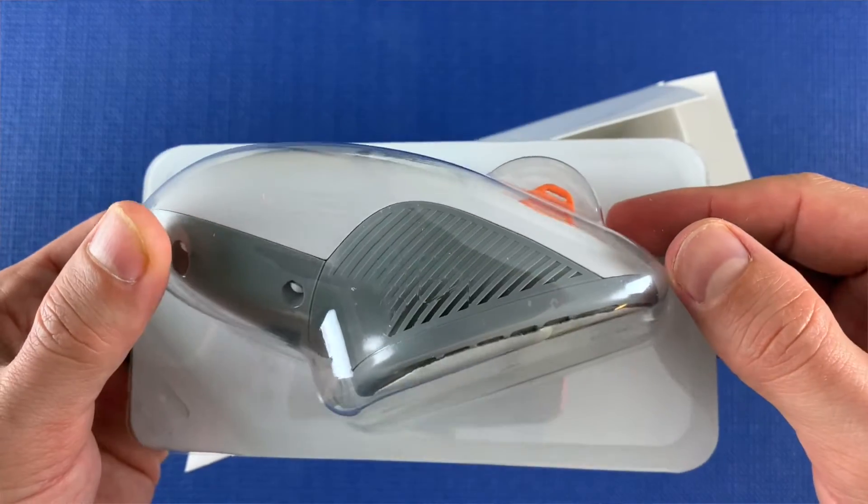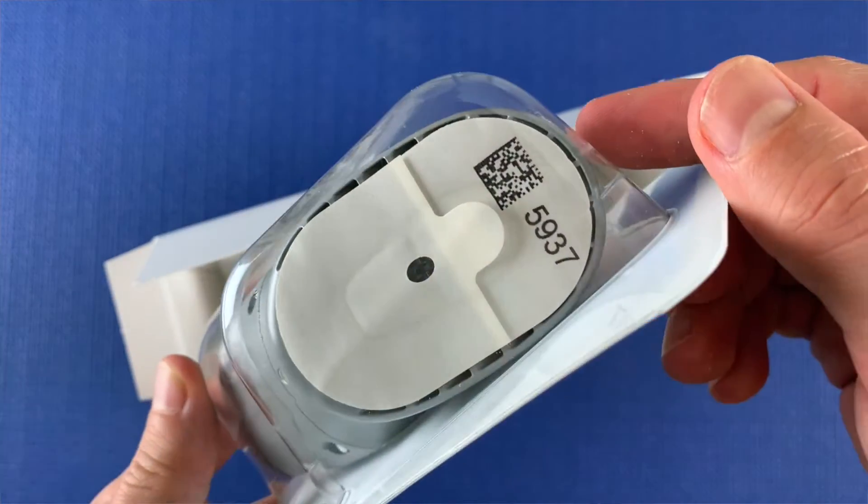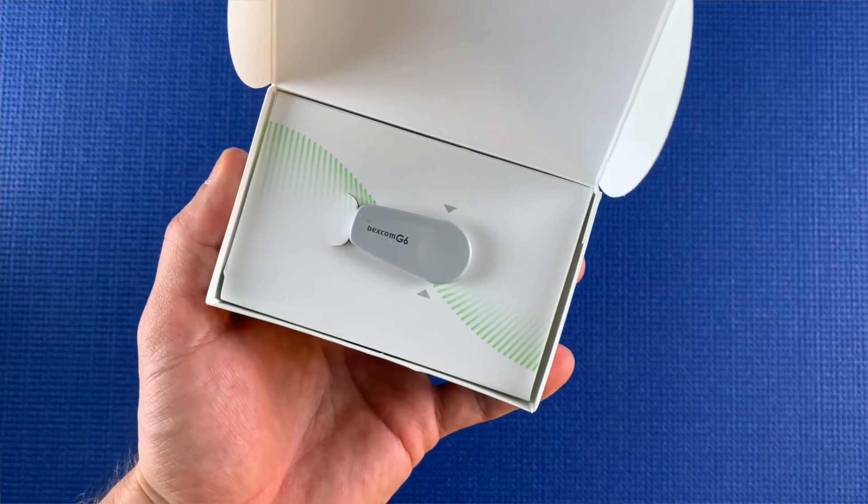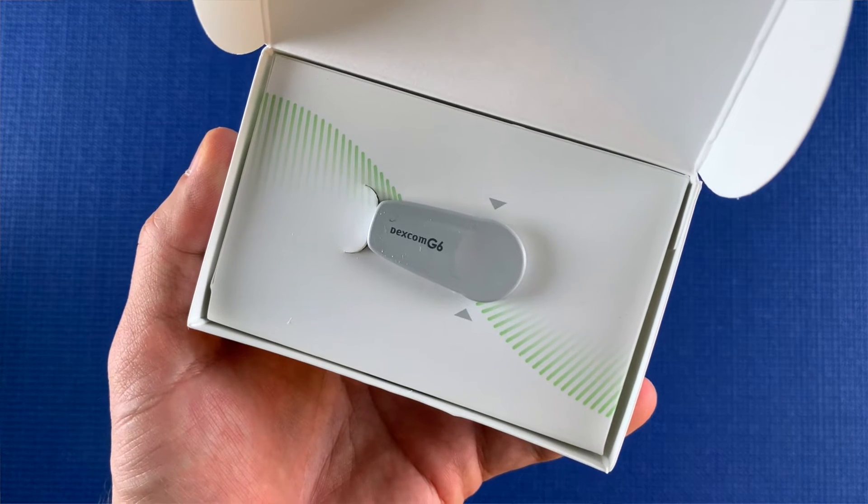You're gonna need the sensor applicator, which you use to attach the sensor to your body, the transmitter which sends the data from the sensor to your phone or receiver, and an alcohol wipe to clean your skin.